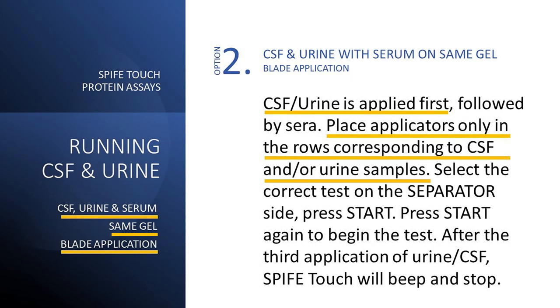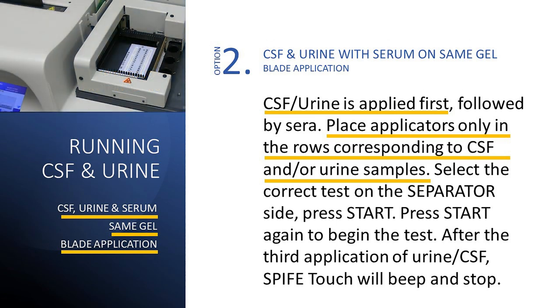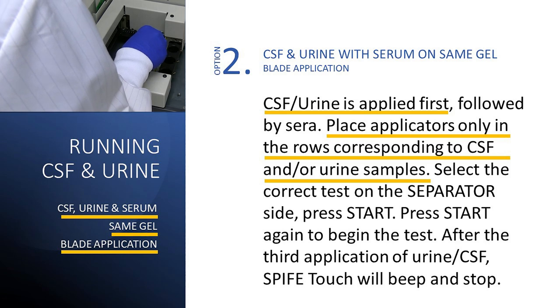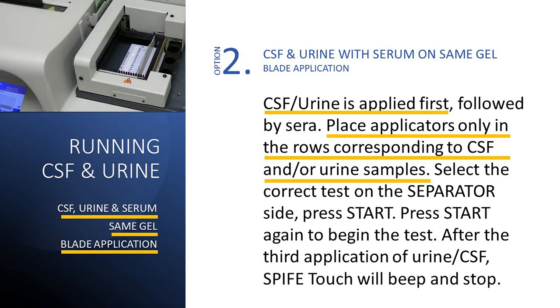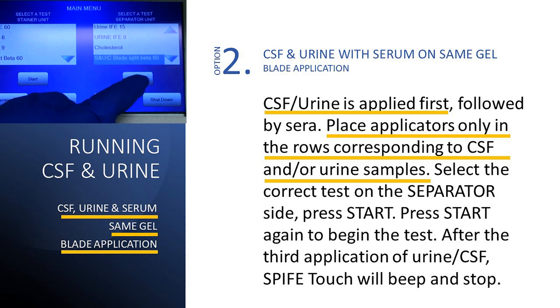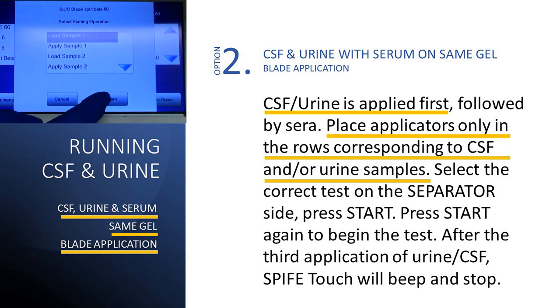To run CSF and/or urine samples alongside serum samples using blade application, when initially setting up the applicator blades, place applicators exclusively in the rows that correspond to the CSF or urine samples. Select the correct test on the separator side, press start, and then press start again to begin the test.